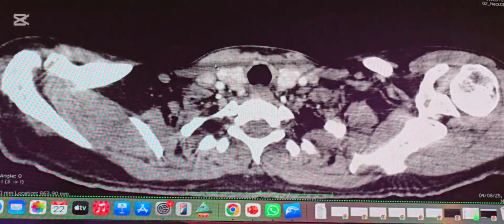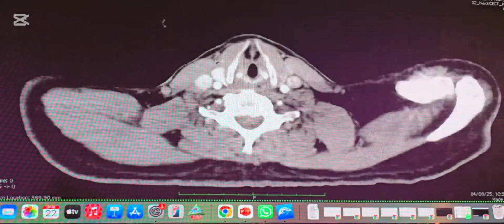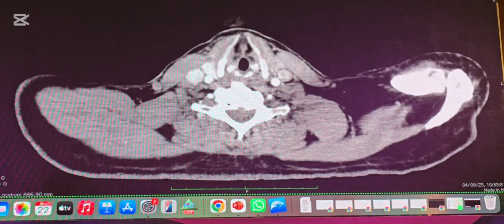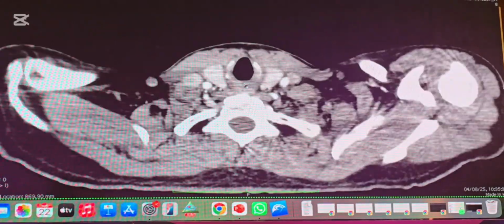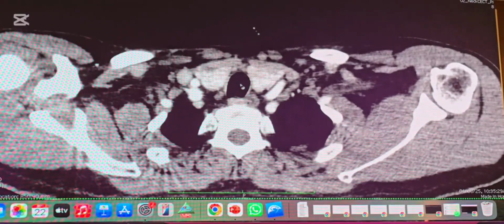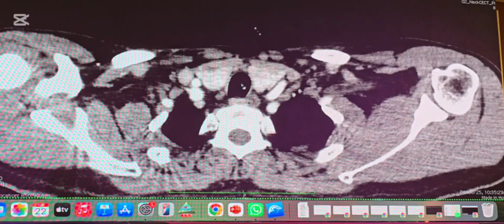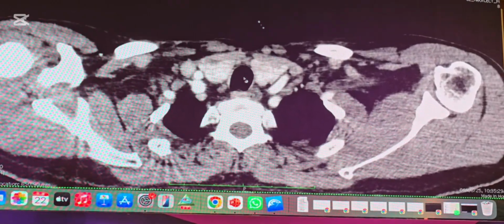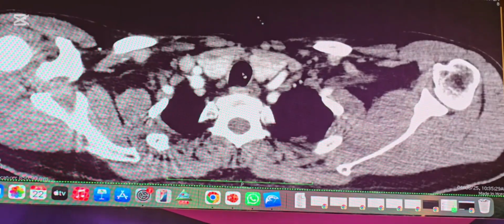So you can see how sternocleidomastoid comes and attaches. So this one is trapezius, the back side. So these are all perivertebral muscles or paraspinal muscles, and this is prevertebral muscles. So we have seen suprahyoid compartment, infrahyoid compartment, and various spaces, visceral space, carotid space, visceral compartment. So if you go one by one, I'm sure you won't be able to miss anything.